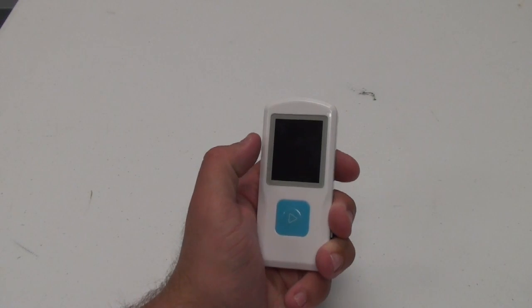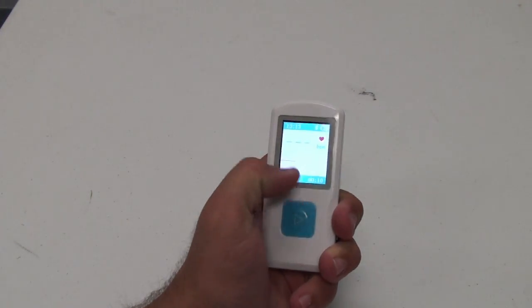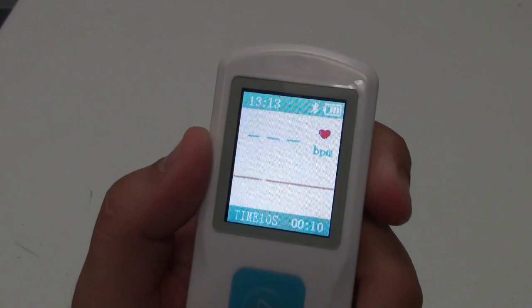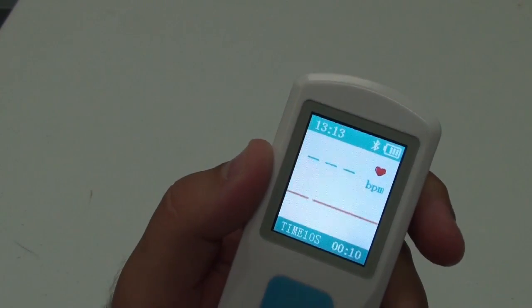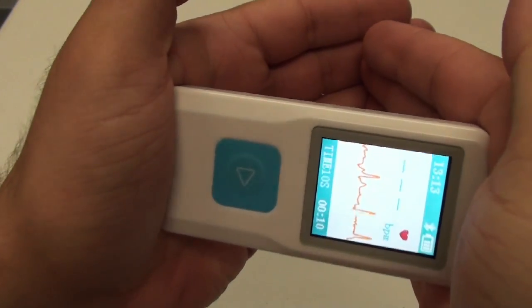The device itself is fairly easy to use. To turn on, just press and hold the middle button. The screen will turn on and you'll notice that there's no readings yet. There are different ways that you'll be able to use this device — by holding it in your hands, it can start to pick up a signal.